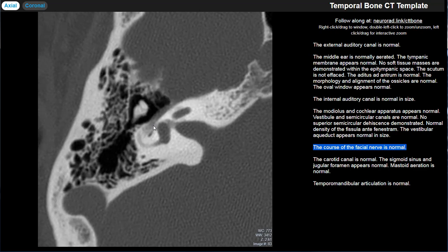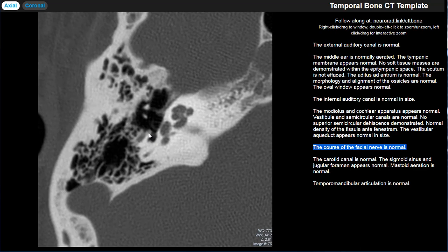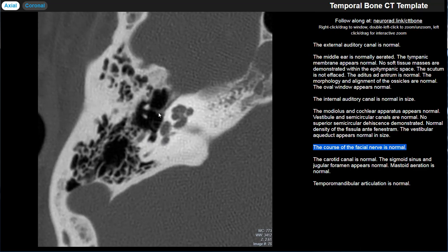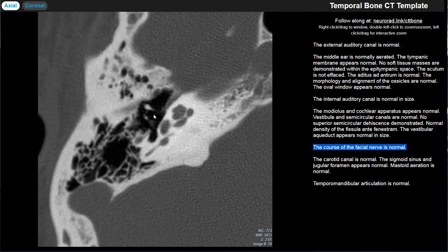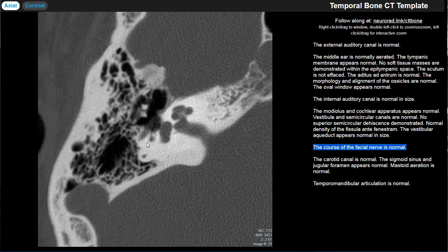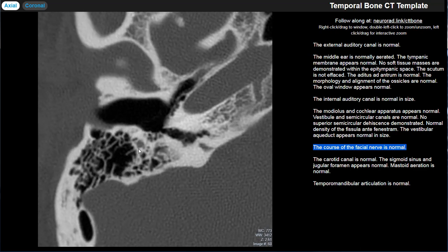A helpful note: the prefix 'tymp' means middle ear. So the tympanic segment of the facial nerve runs through the middle ear, the tensor tympani is a muscle through the middle ear, the tympanic membrane is the covering of the middle ear, and the tegmen tympani is the superior covering over the middle ear. Continuing inferiorly, the facial nerve becomes the mastoid segment, right next to the stapedius tendon, and then exits through the stylomastoid foramen.